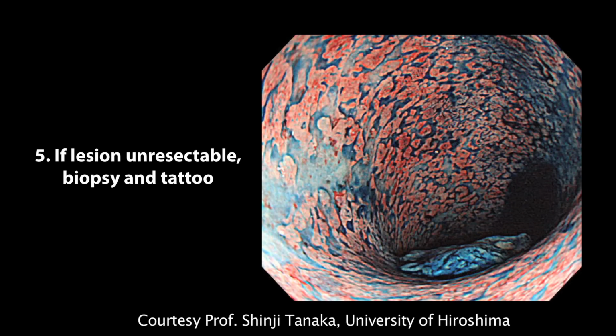By contrast, when the endoscopist feels a lesion is unresectable or is uncertain whether the lesion is malignant, biopsies should be obtained from the lesion. In addition, biopsies should be obtained from the adjacent mucosa to exclude unrecognized dysplasia.